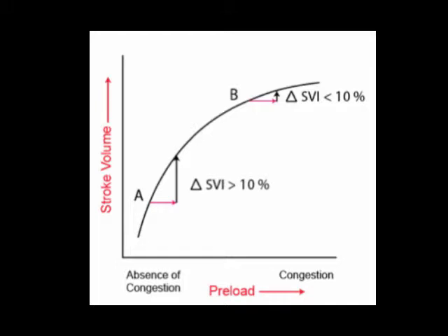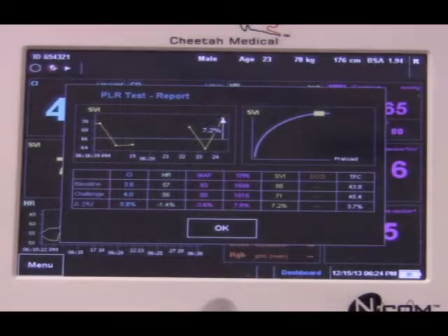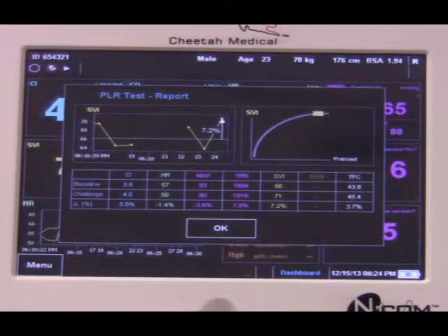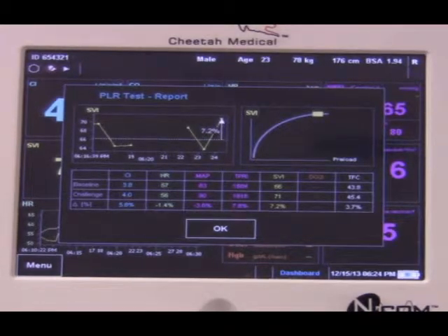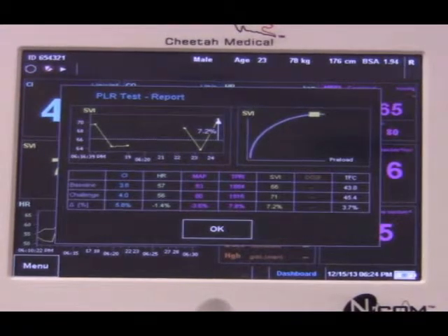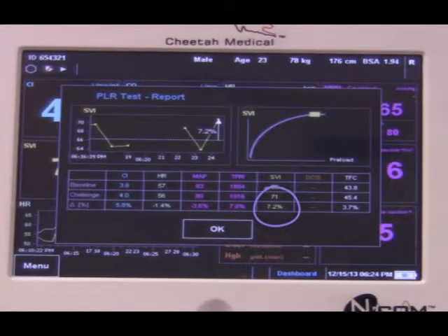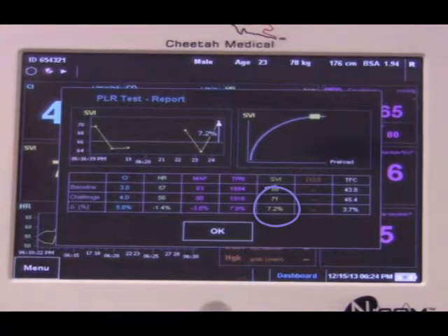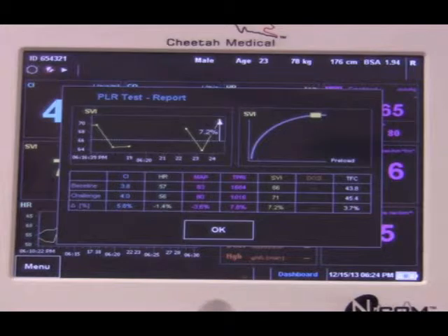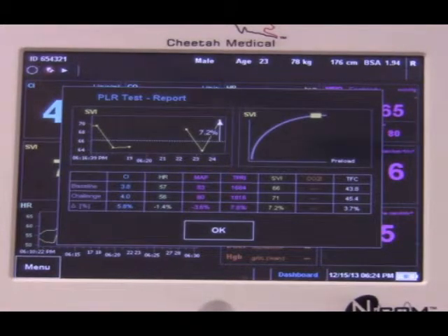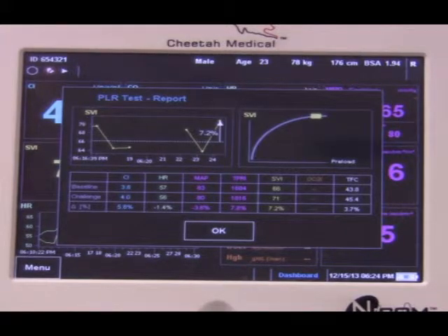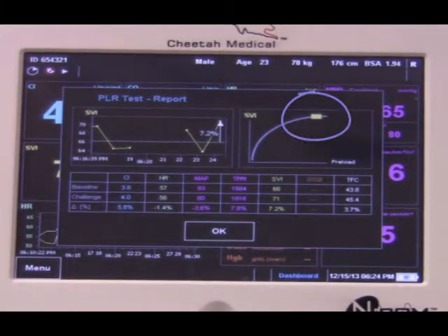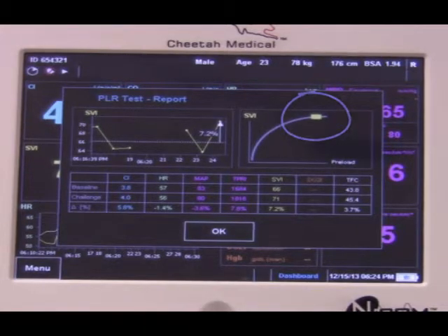An increase of greater than 10% in the stroke volume index following the bolus fluid test or the passive leg raise test suggests the patient is on the ascending limb of the Frank-Starling curve and is fluid responsive. The passive leg raise test has just been completed. The results are presented in a table similar to the bolus challenge test results seen previously. The change in SVI for this patient is 7.2%. An increase of more than 10% would have suggested that the patient was fluid responsive. This result does not support the administration of additional intravenous fluids. The result is also displayed on a Frank-Starling curve, showing the patient is on the flat portion of the curve and unlikely to benefit from an increase in preload.